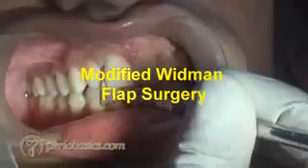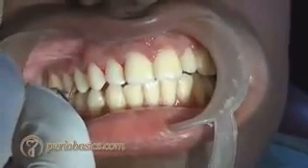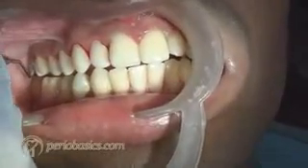And now let us see how a modified Widman flap surgery is done. So we have a patient here with chronic generalized periodontitis. You can see the moderate to deep pockets. The pockets are deep, especially in maxillary posterior area.